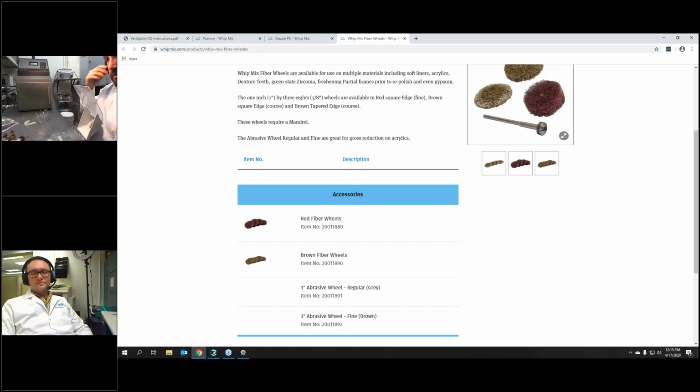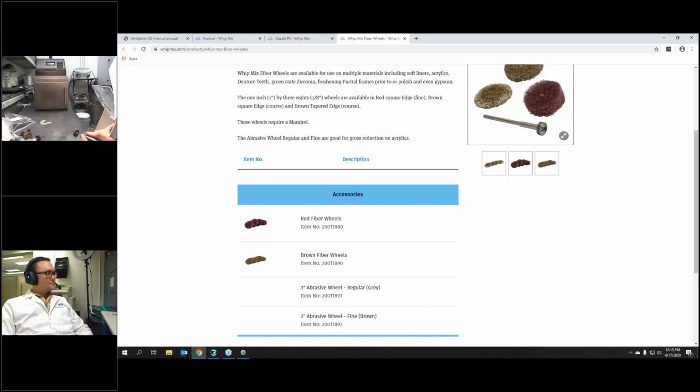Of course, safety first. Doing this best we can. All right. So I'm going to go ahead and go at a slow rate of speed. For mine, I think I'm doing 6,000 RPMs. So I'm just going to lightly take away those support pins.